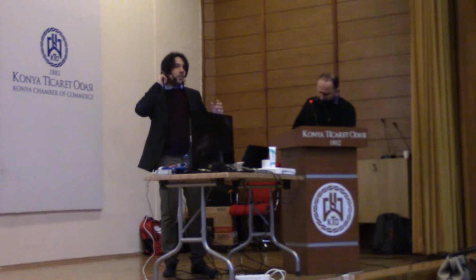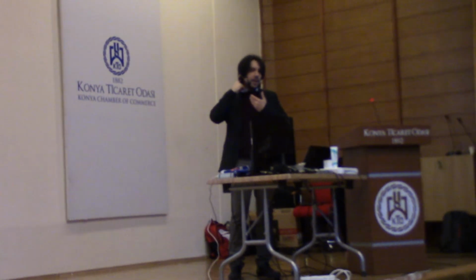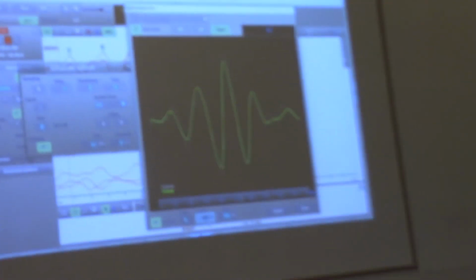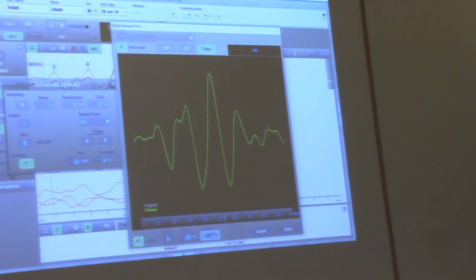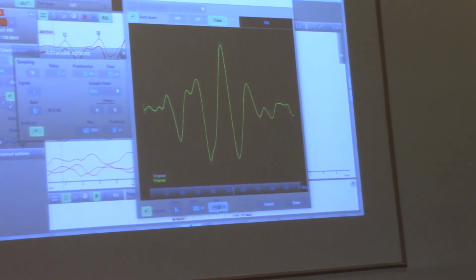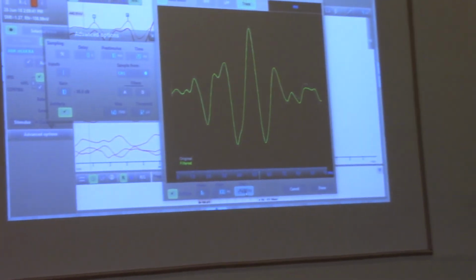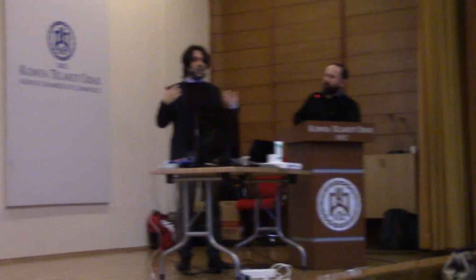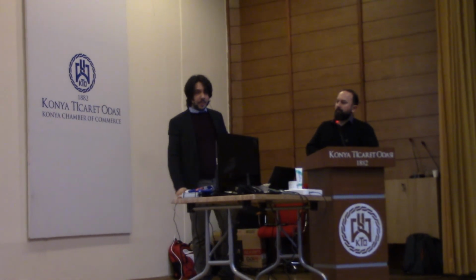And in fact, if you have a postauricular muscle artifact, it will interest the part of the ABR that is soon over the fifth peak. So it happened to you to have a big mountain after the fifth peak. That big mountain is a postauricular muscle artifact. Okay, so just take care about the position of the electrodes, the relaxed status of the patient, and you will see this decreasing. Decreasing the postauricular muscle artifact, it will increase the fifth peak. Statistically, it's normal.